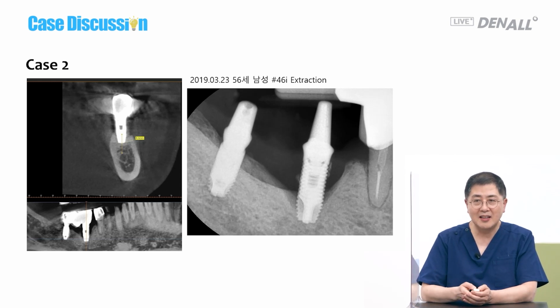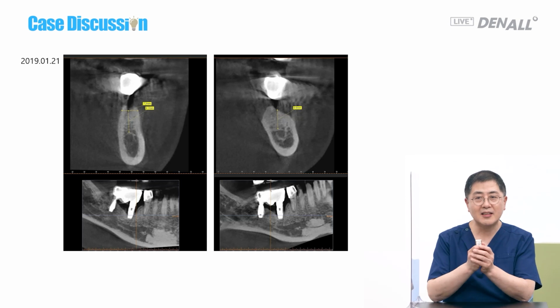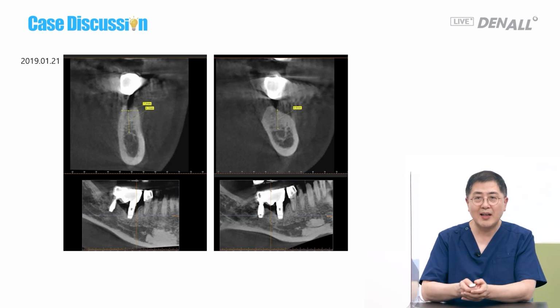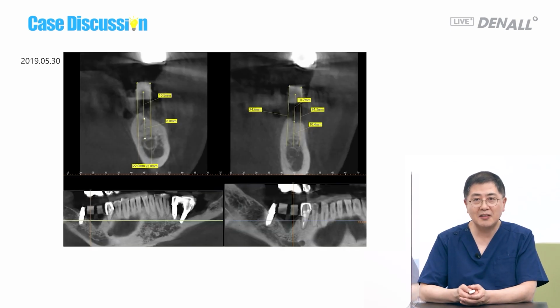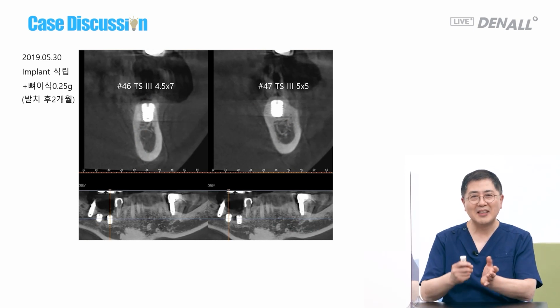Implants done in another clinic failed. It was very close to the nerve. At number 46, mesially and distally, there was bone, so I waited, and the bone was forming. Ostem has short implants. I did my favorite guided surgery. I placed the implants. I should mention the brand name, but I did the bone grafting.